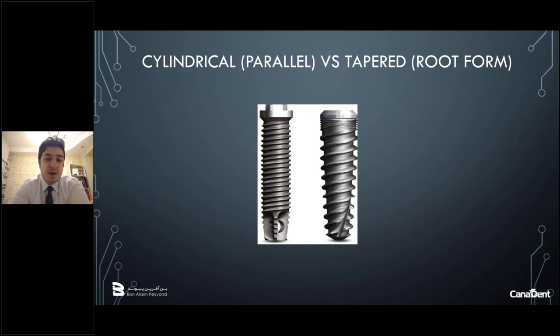For self-tapping designs, the surgical protocol normally dictated an osteotomy that conformed to the inner diameter of the screw, allowing the threads to cut their way into the bone during insertion. But tapered screw designs have increased initial stability and anatomic conformity. They have improved primary stability because they condense bone in areas of reduced bone quality. So they are somewhat advantageous over the parallel-sided implants.